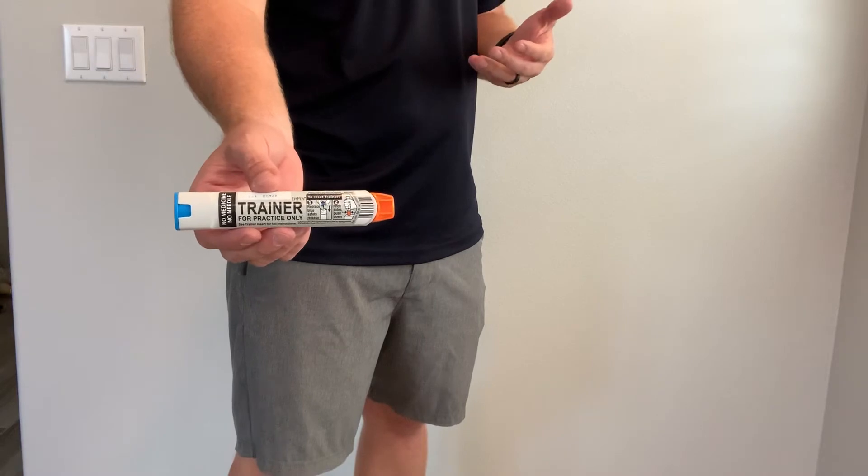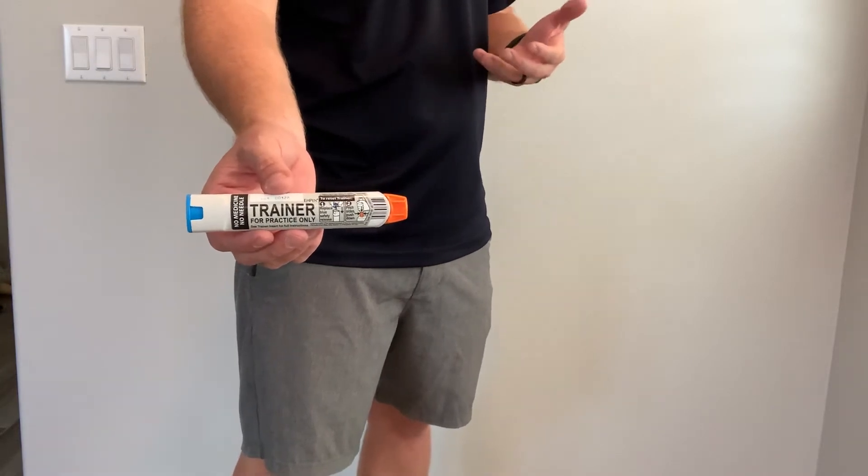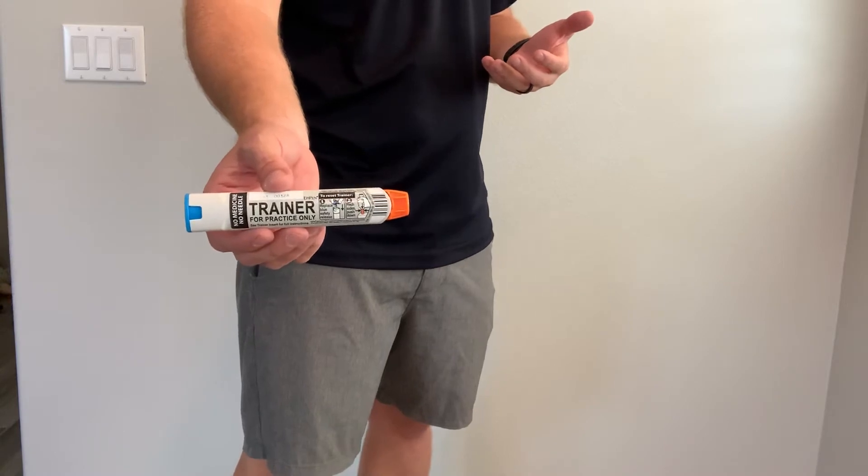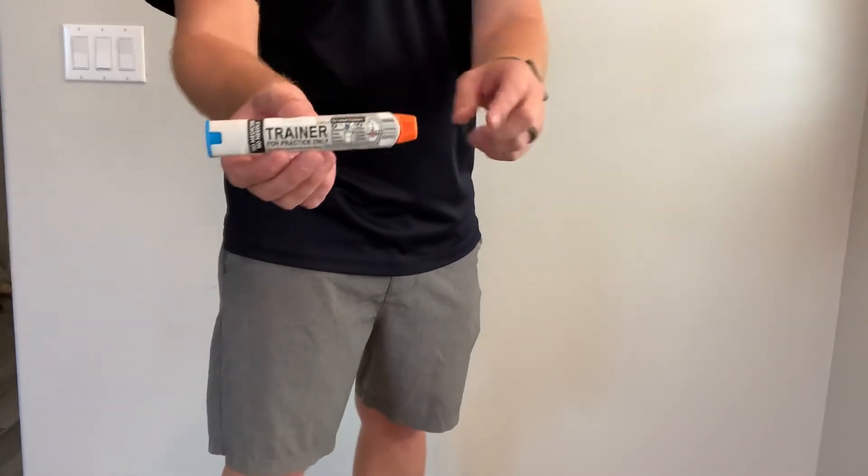Let's say we have an outdoor athletics activity where somebody got stung by a bee and they were very allergic to bees and had their EpiPen. What we could do to administer this is grab their EpiPen.